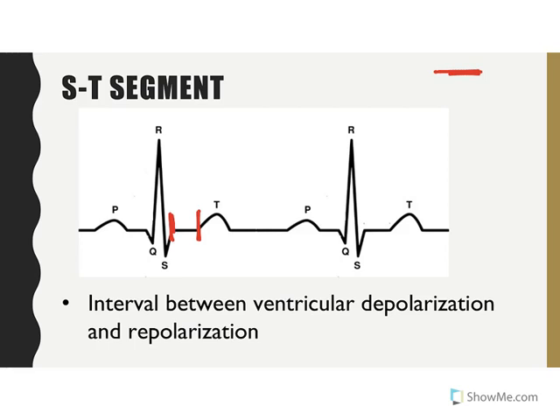If it's not, we do have a little gimme where it can be above or below a little bit, but if it's elevated or depressed, it indicates a pathology. It could be myocardial ischemia, a myocardial infarction, pericarditis. It usually indicates something's wrong.